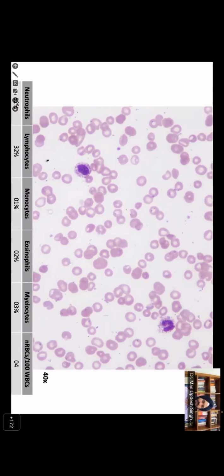So again, there is a leukoerythroblastic picture, but still low counts, right? And it's sort of toxic changes. The granulations might not be too coarse or dense, but there's some reaction in the granulocytes. What else could you see in toxic granulocytes, neutrophils? There could be vacuolations, there could be coarse granulations.